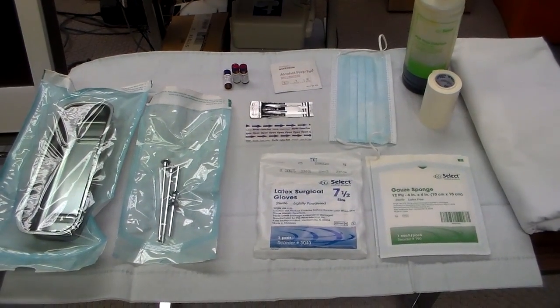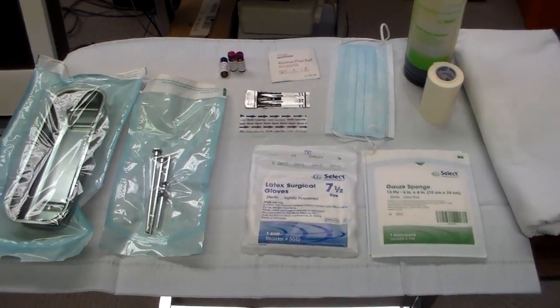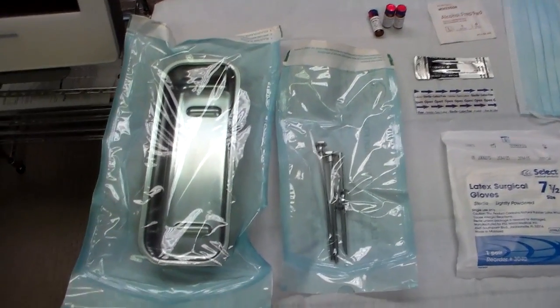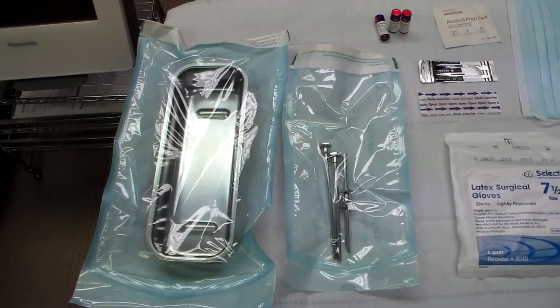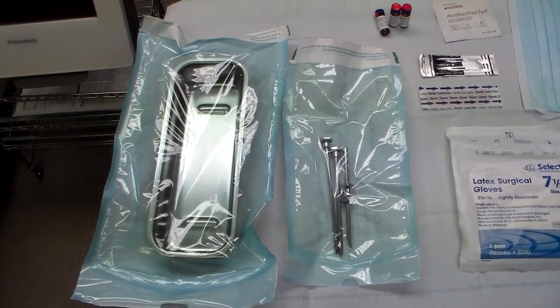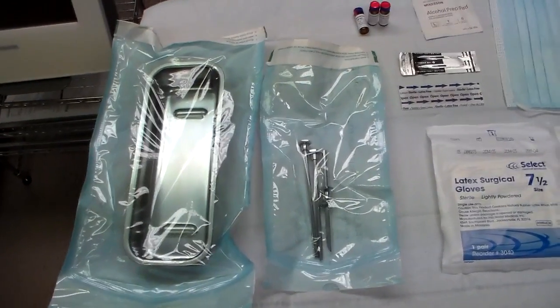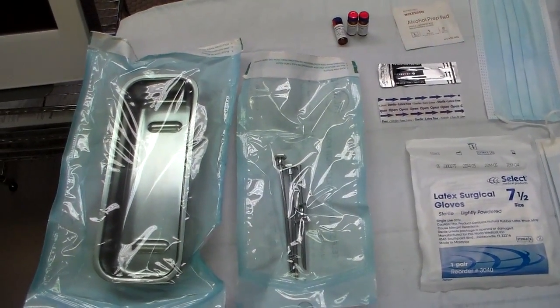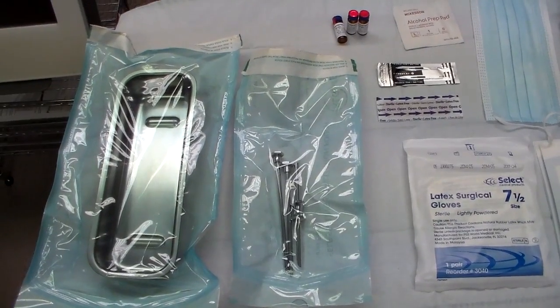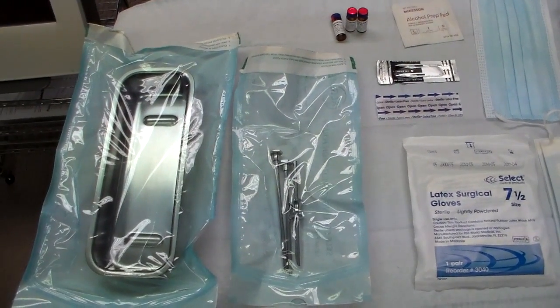What the clinician wants to have available is very simply an implantation set, which includes a sterile tray, and next to this is the trocar set. The trocar set has three individual components: the trocar, the stylet, and the plunger.